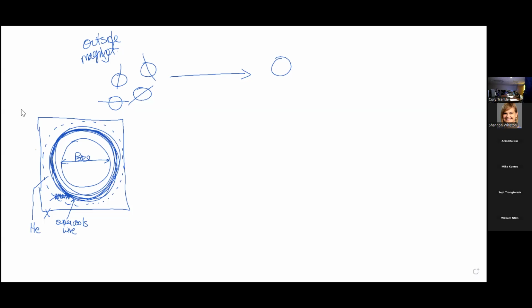Once you put that charge in, that magnet is always on. It's never turned off because that current's put in there. So inside the bore of this magnet, the magnetic field is 40,000 times that of the Earth.